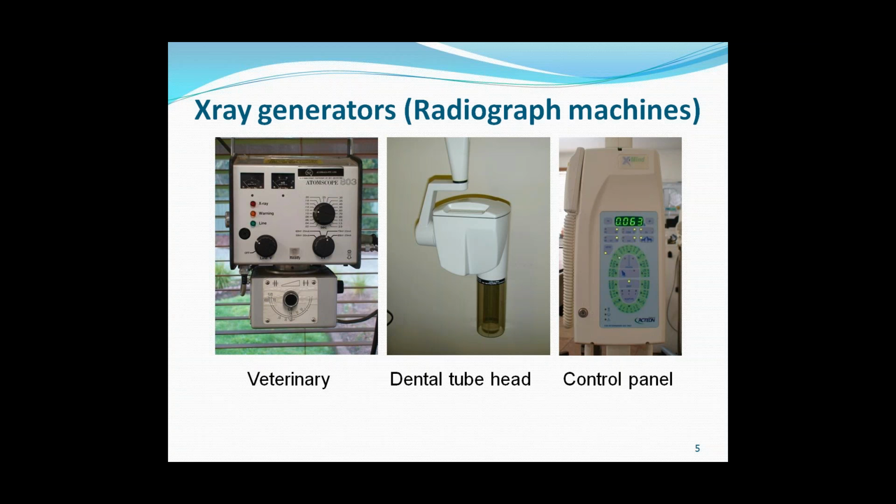So in many ways, it's much easier to determine what settings to choose on an X-ray generator for the mouth compared to the rest of the body.